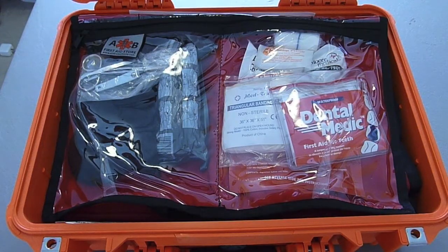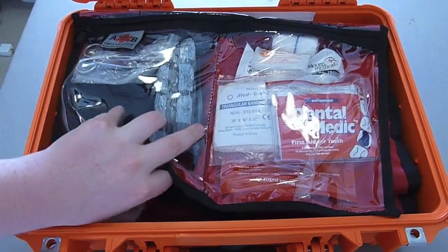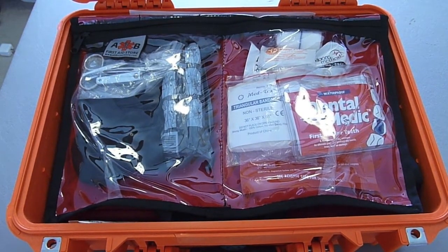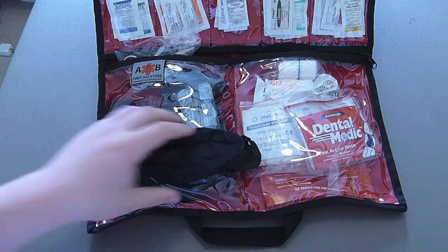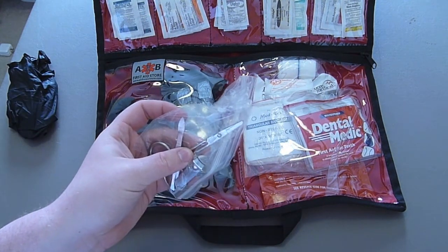What I have on the interior of my case is extremely similar to what I have on the lid, and this helps keep my case organized. AB First Aid Store also designed a multiple-level folding organizer that fits in the interior of the case. We'll pull it out one level at a time. So what we have here are some nitrile gloves, a pair of tweezers, nail clippers, and small bandage shears.